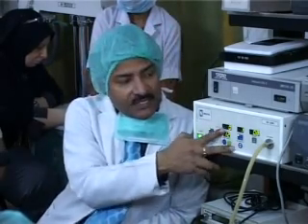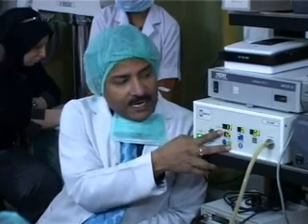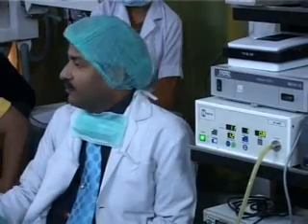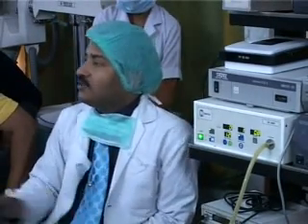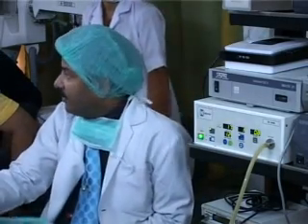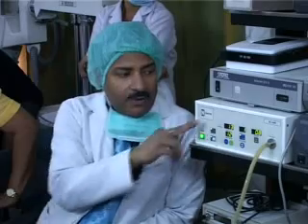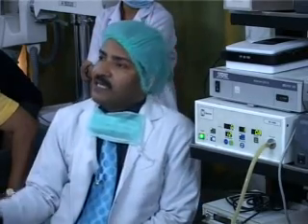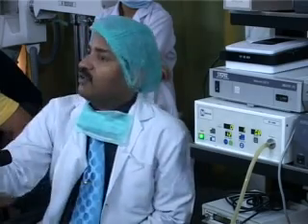Sometimes you can see it is 0, sometimes 17, again 0, again 13, again 0. That means the minimum is 0. So the actual pressure is right now 0. Why is it 0? Because gas is going into the atmospheric pressure. It is not building up anywhere. So this is the property of the insufflator, that initially with the Veress needle it gives pulsatile flow.